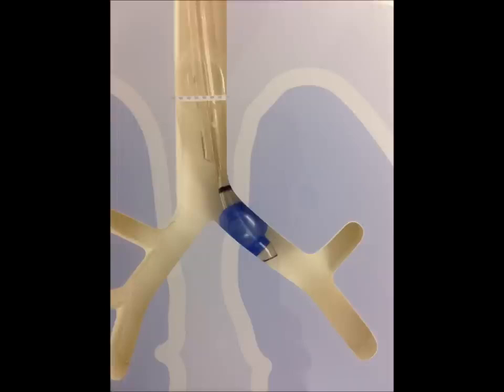And you can see this is a well-placed left endobronchial tube, and it's perfectly placed. You can ventilate everything. If you're ventilating the left lung, you ventilate through the left endobronchus. If you're ventilating through the right lung, you ventilate through the tracheal port. And if you're ready to ventilate both, then ventilate through both.